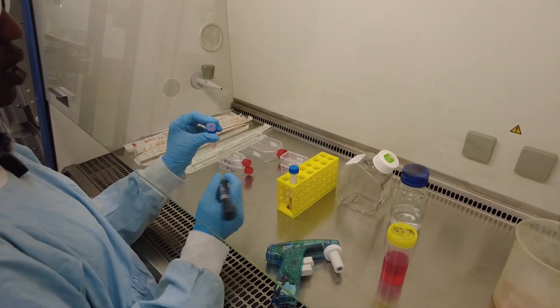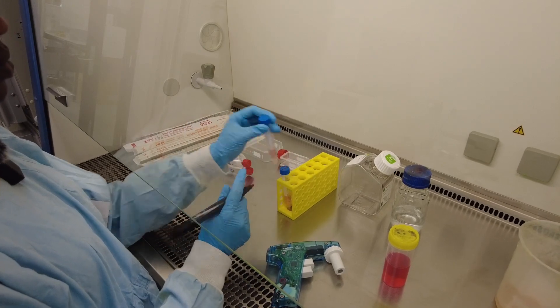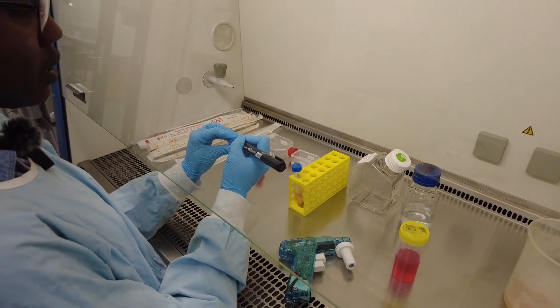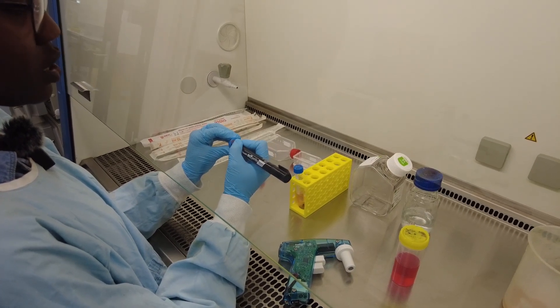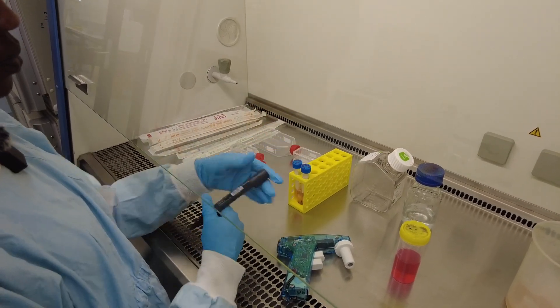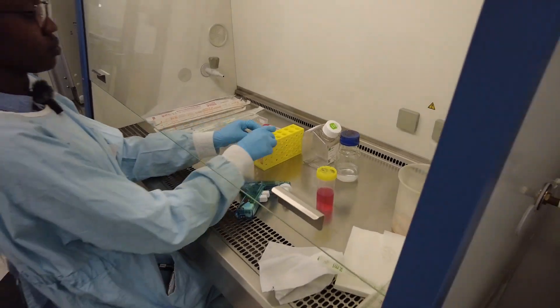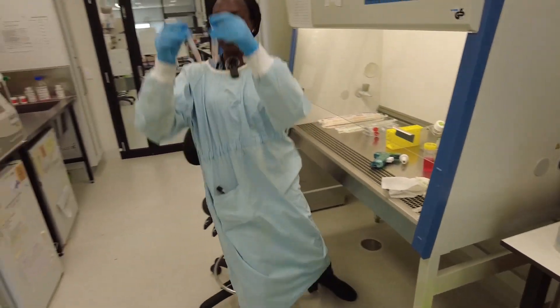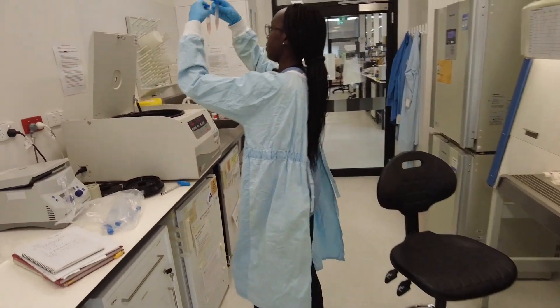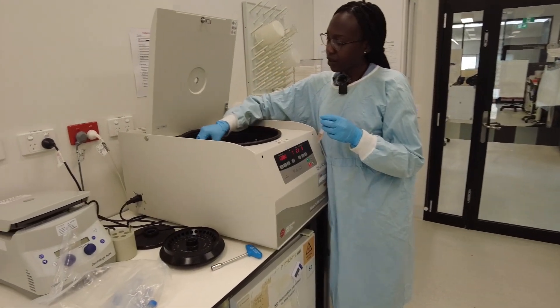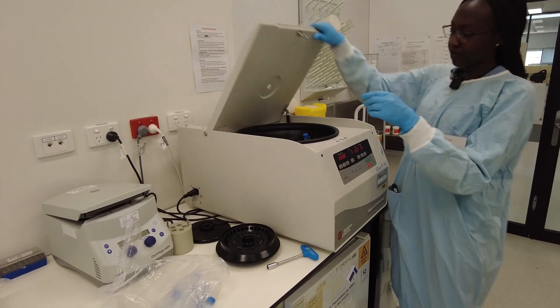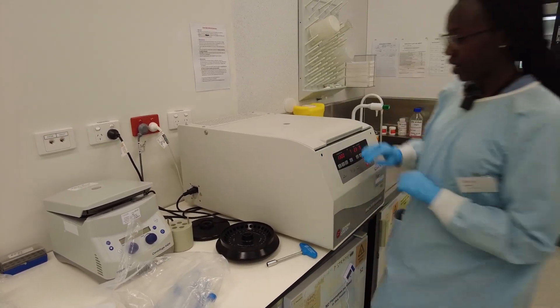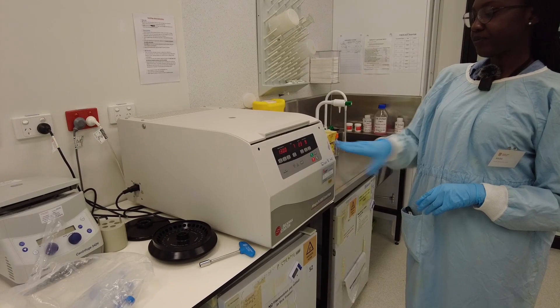So we'll call this tube number 2. And we'll call this one tube number 2. Now we're going to put them opposite to balance the centrifuge. Lock it in place and press start and we'll be back when the centrifuge is over.